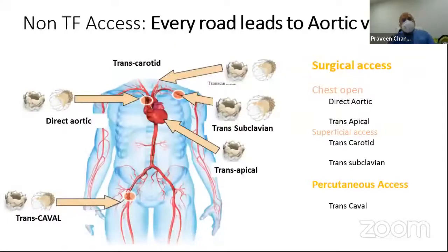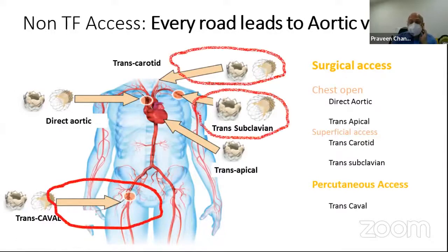So what are the accesses? And here you can see that if there is no transfemoral access, we can look at the subclavian access or the axillary access, the transcarotid access, and also the transcaval access. So basically, we have to look at these options in a particular patient.